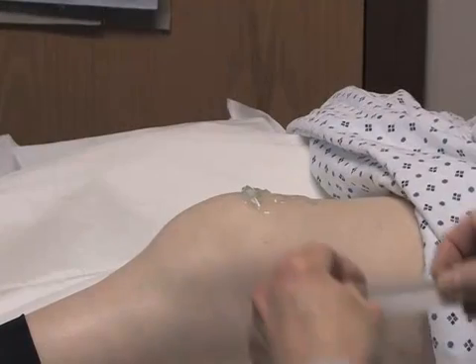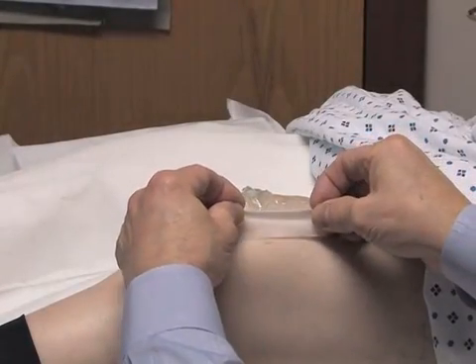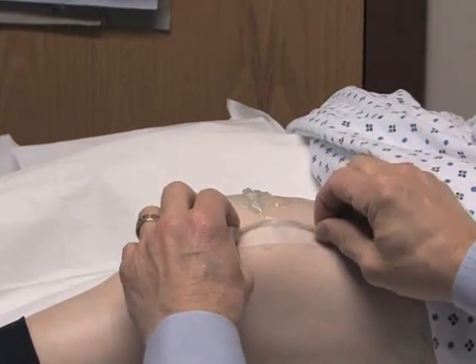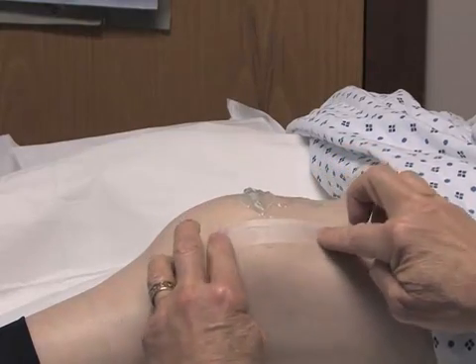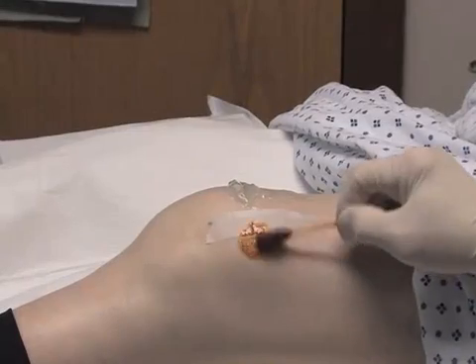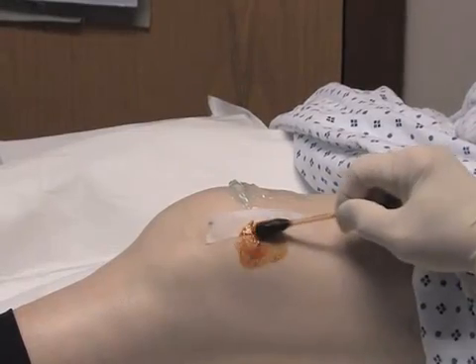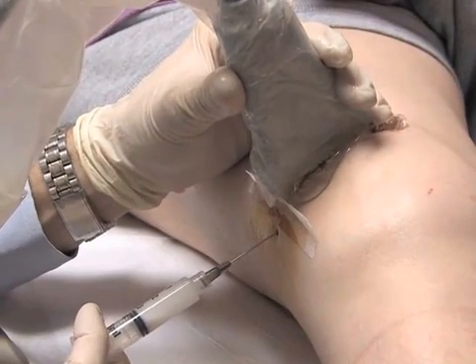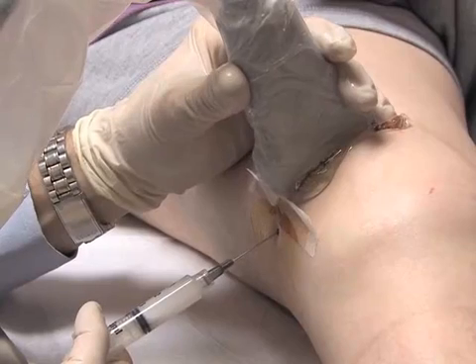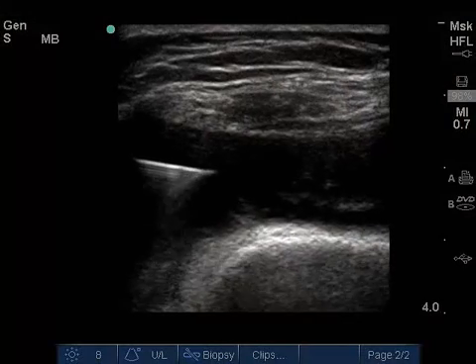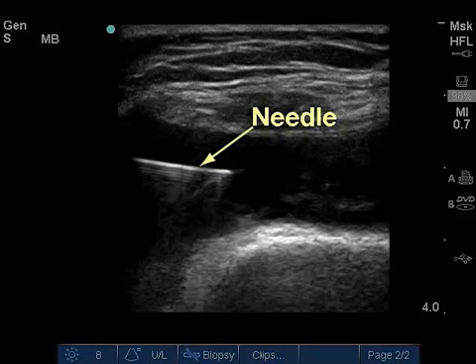In the example seen here, the effusion has been visualized and an injection site chosen and marked with an indentation in the skin. A strip of non-sterile tape is folded and applied, forming a barrier between the injection site and the ultrasound probe. The injection site is then sterilized in the usual fashion. This procedure can be performed under real-time ultrasound guidance. With the ultrasound probe in the transverse plane, the needle is inserted along the axis of the probe. This should result in the visualization of the needle as a hyperechoic line, which is often accompanied by a typical ring-down artifact.